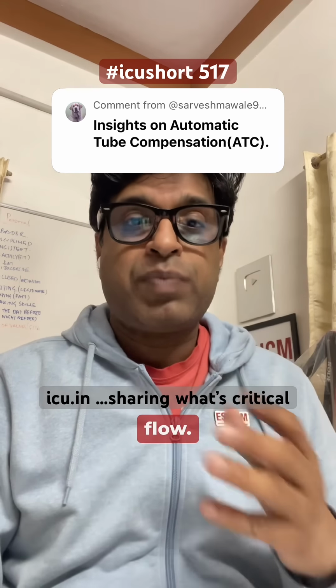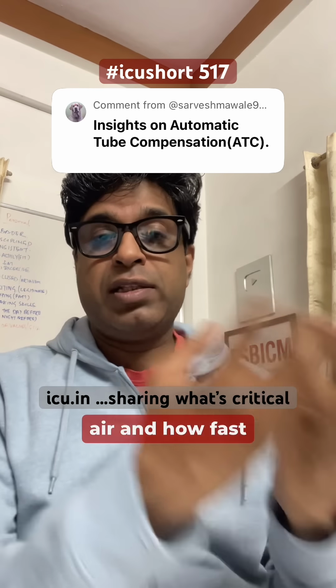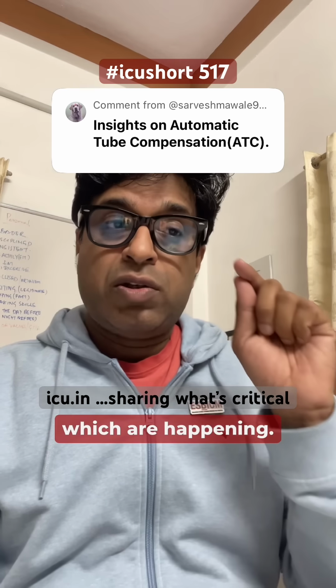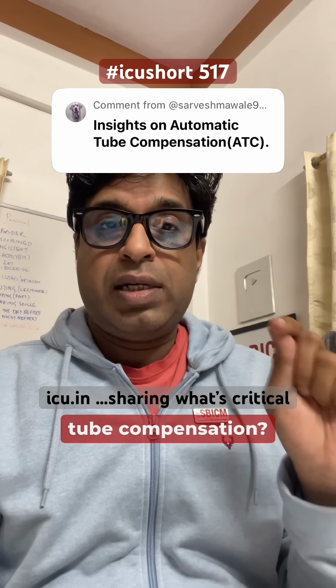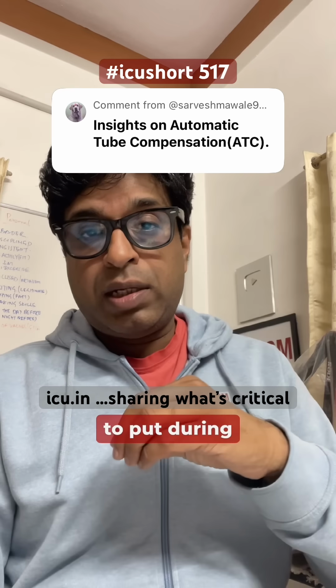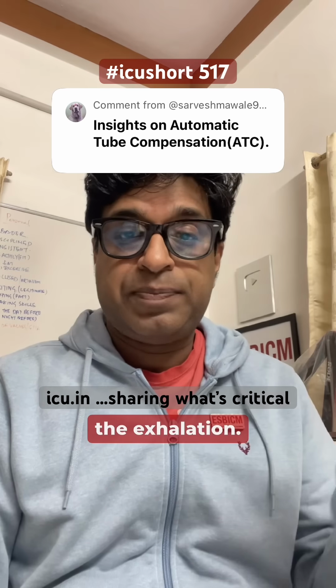And third is the flow, how fast the patient is sucking the air in and how fast the patient is exhaling. So these are the dynamic changes which are happening. So what automatic tube compensation does is it calculates the amount of pressure required during the inhalation, and it negates it during the exhalation.